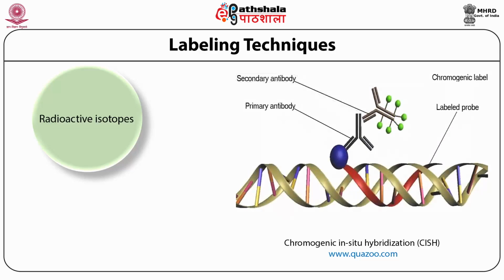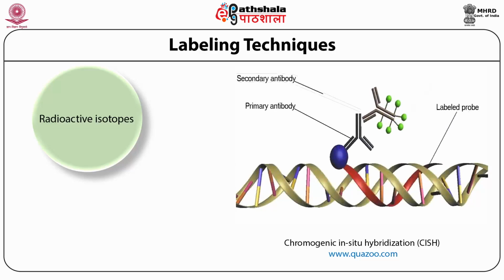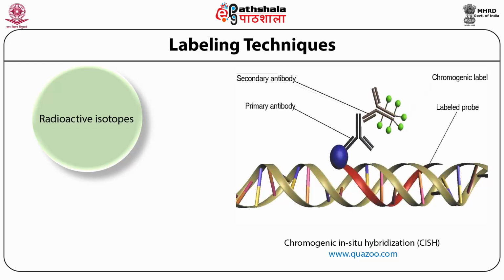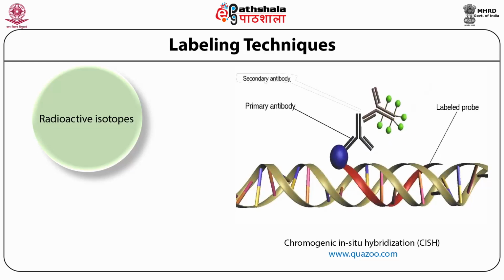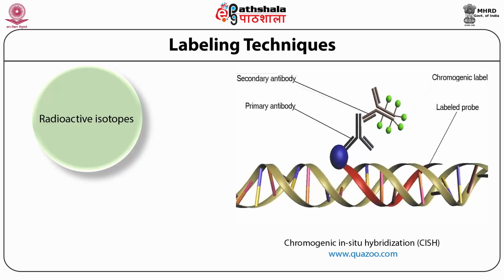Radioactive reporters include H3, P32, S35, I125. The most commonly used isotope for ISH is H3 and produces high-resolution autoradiographs. Although it allows precise localization of signals, long exposure times are needed. However, for low copy number detection of transcripts, S35 is the label of choice.